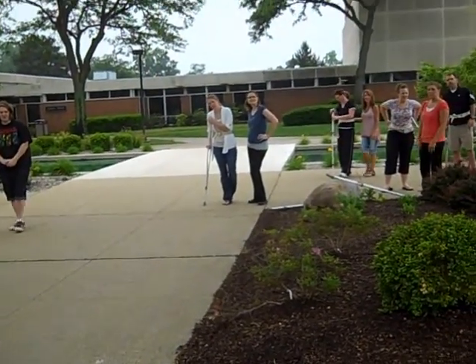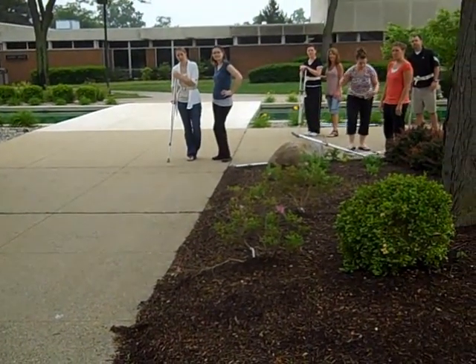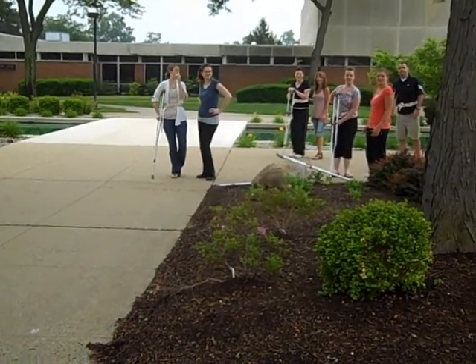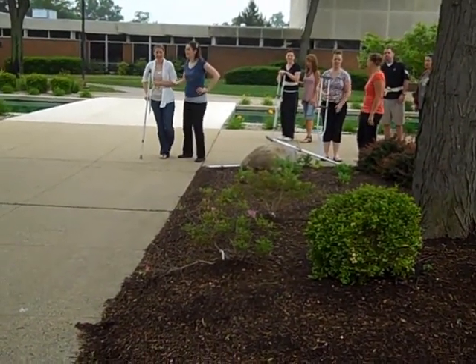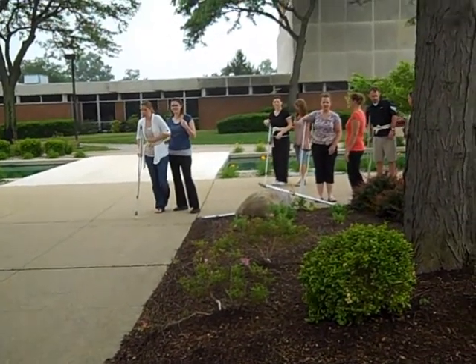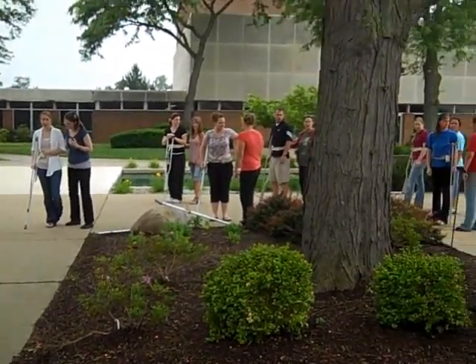Alright, your patient has hemiplegia — left-sided hemiplegia. A right-side CVA would result in left-sided hemiplegia. Go ahead and teach your patient: what gait pattern are you going to choose?